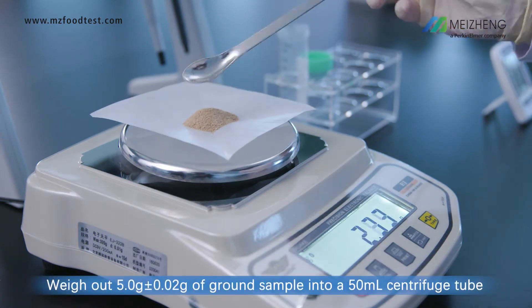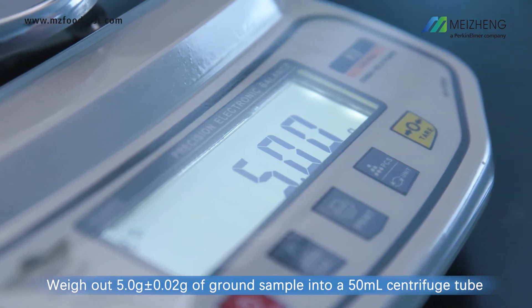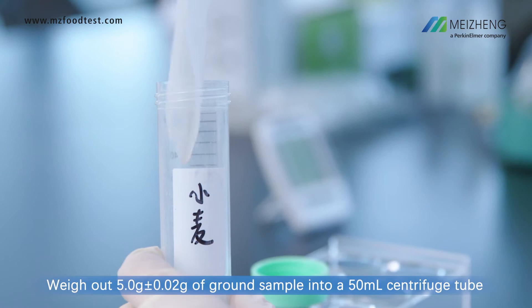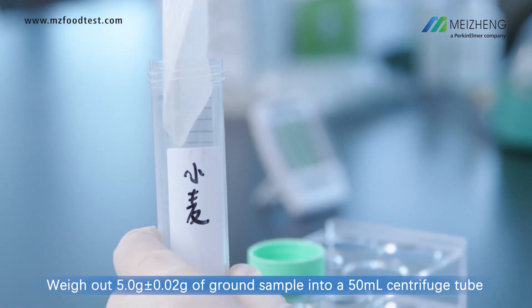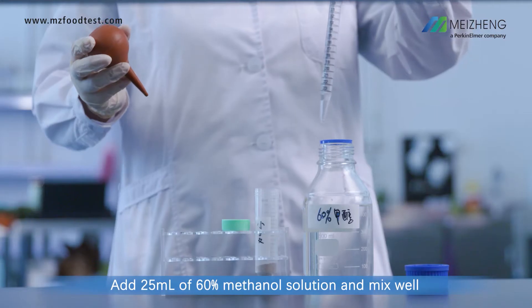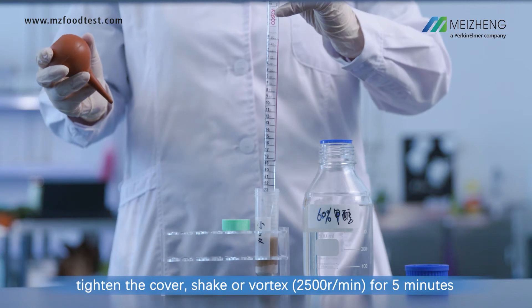Weigh out 5 grams of ground sample into a 50 milliliter centrifuge tube. Add 25 milliliters of 60% methanol solution and mix well, then tighten the cover.